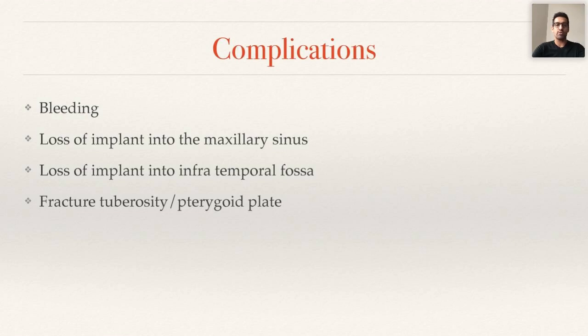There's a real risk of losing an implant into the maxillary sinus. Up until 4 weeks ago, I had never done that. But 4 weeks ago, placing a pterygoid implant on the left-hand side, I inadvertently pushed it into the sinus and I absolutely bricked it, because I thought I'd actually put it into the infratemporal fossa. But it was okay. It was just in the sinus, no big deal. I made a window and took it out.